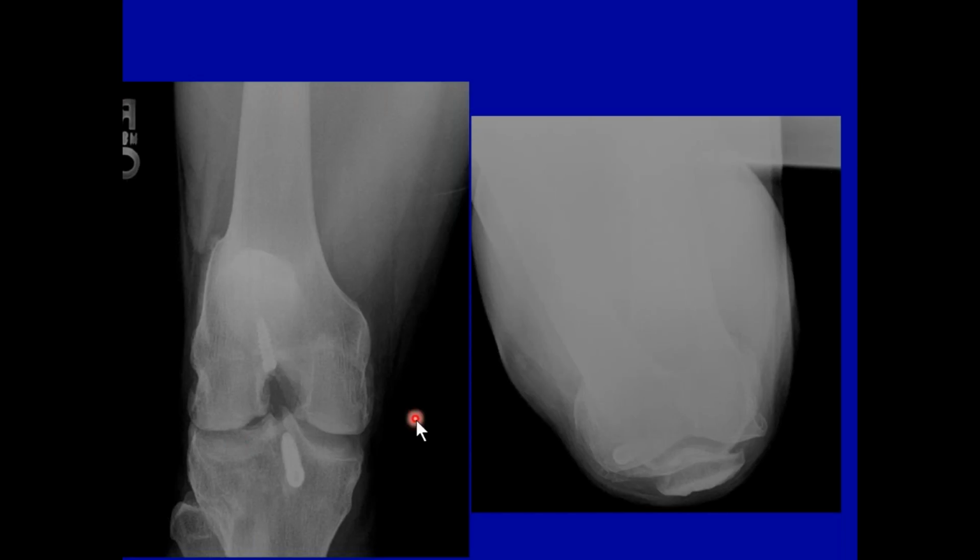Well, on the previous x-rays, we saw the graft. We don't have to repeat the examination, but if he's developing degenerative joint disease behind the patella, you would be asked to do a sunrise or skyline view of the patella. And there's still enough time for you to understand how to do that, but I'm just painting the clinical scenario where you'd be asked to do that particular examination.